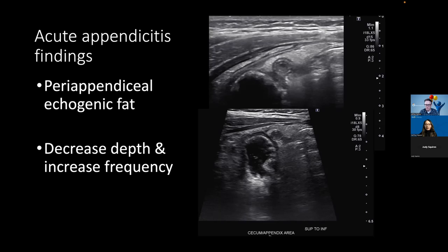Yeah, that's a really great idea and thought. I never thought about incorporating it. We might try starting to look for it. Do you have a lot of success finding the TI and cecum in babies when you do the malrotation volvulus ultrasound? I guess we're diverging, but yeah, it's definitely more challenging.